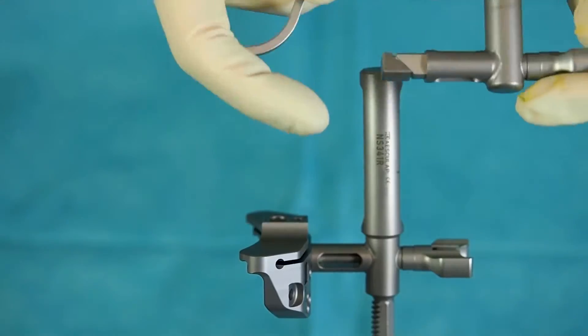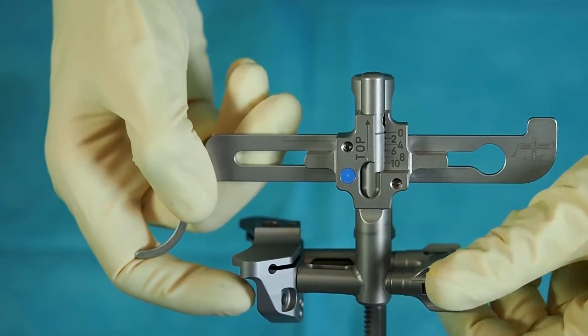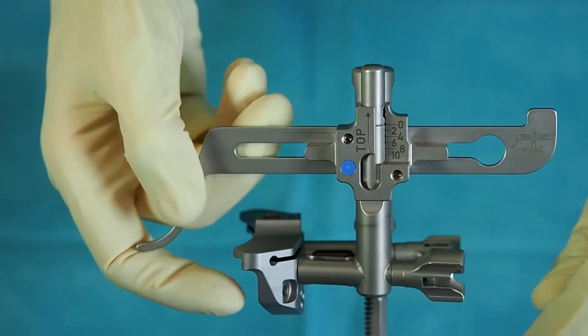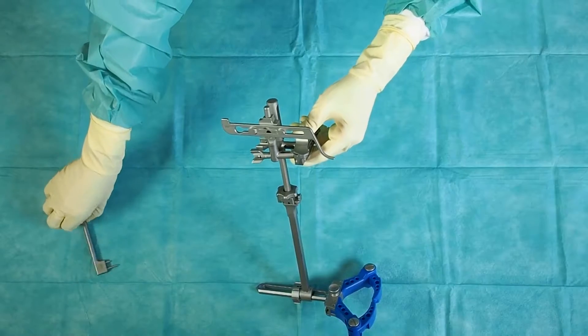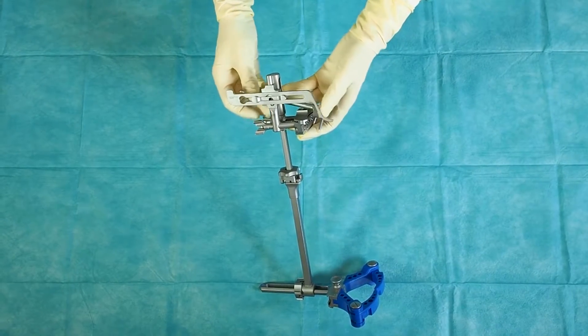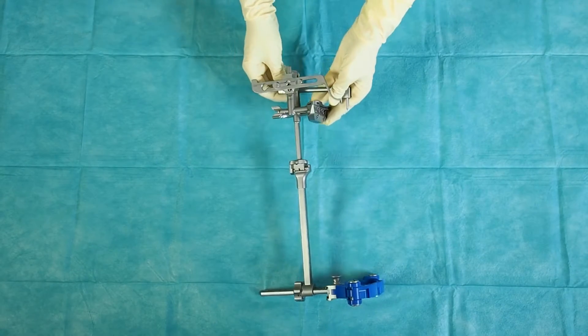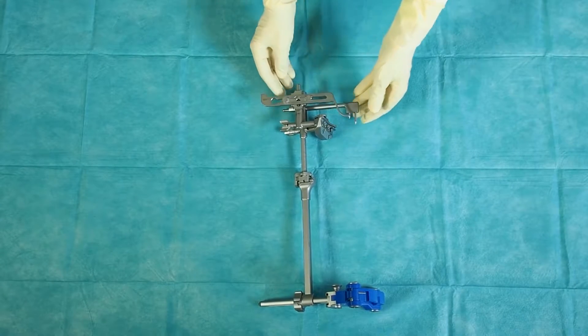The connection square of the stylus is engaged in one of the connection squares of the tibia cutting guide. The connection is fixed by locking the wheel on the stylus. The proximal fixation is put through the proximal opening of the holding rod. Turn the tab into a horizontal position to fix the assembly.